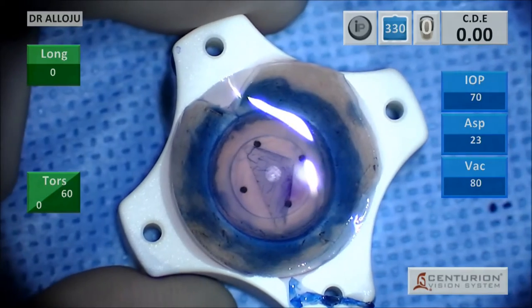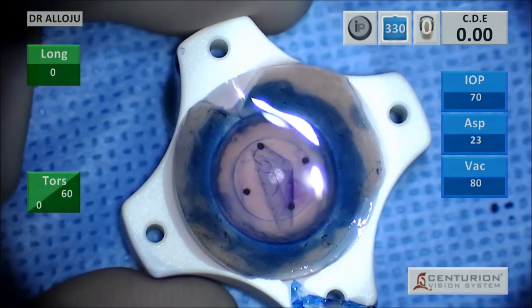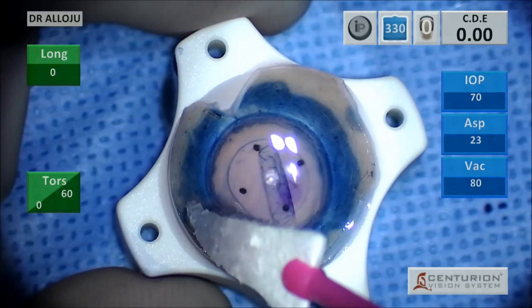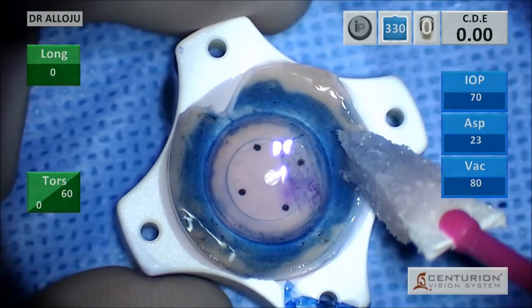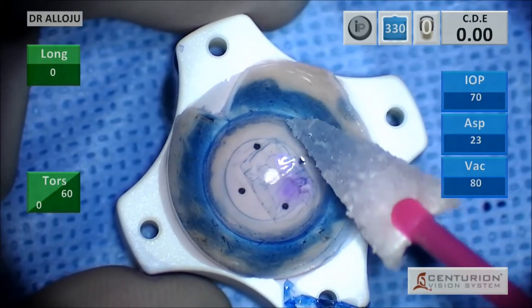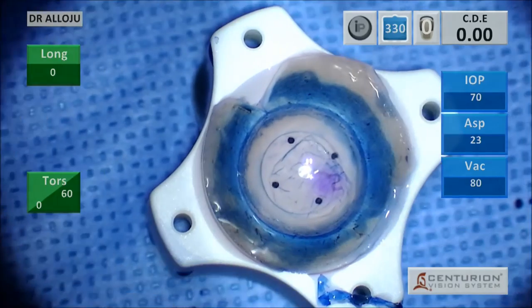I have had a tear where I've lifted it all the way off once, and since then I've kind of adopted this maneuver. Once I've freed up the graft and laid it back down within the solution, it's time to draw up as much of the solution as possible. You want to be careful here not to touch the graft with your Weck-Cel.